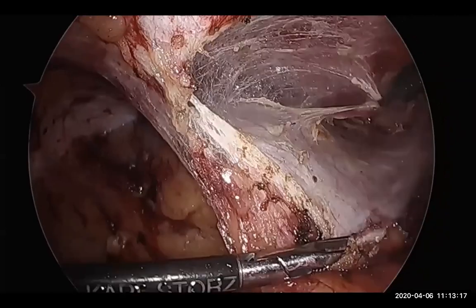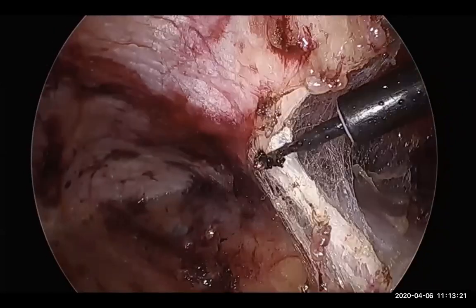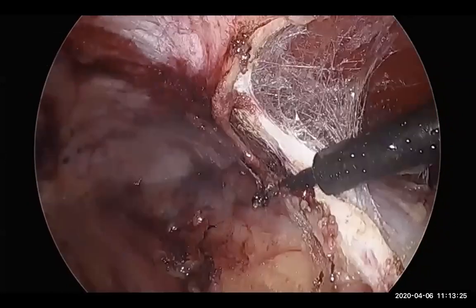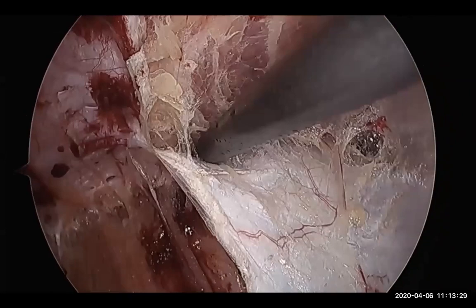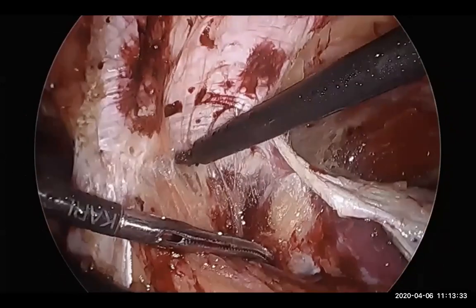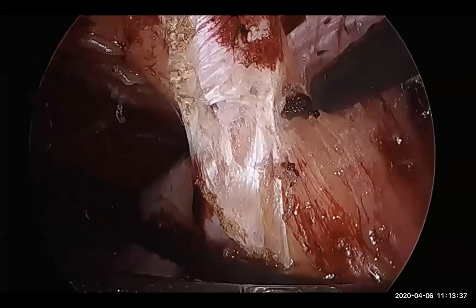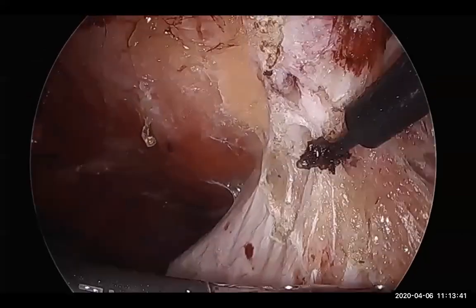Okay, so this is retrorectus dissection on the right side. This is division of the PRS on the right side. The camera is at the upper left. So you're looking down, and you can see that the PRS is increasingly being pushed down, and we are staying extraperitoneal throughout. Care is taken not to go into the peritoneal cavity or into the linea alba.